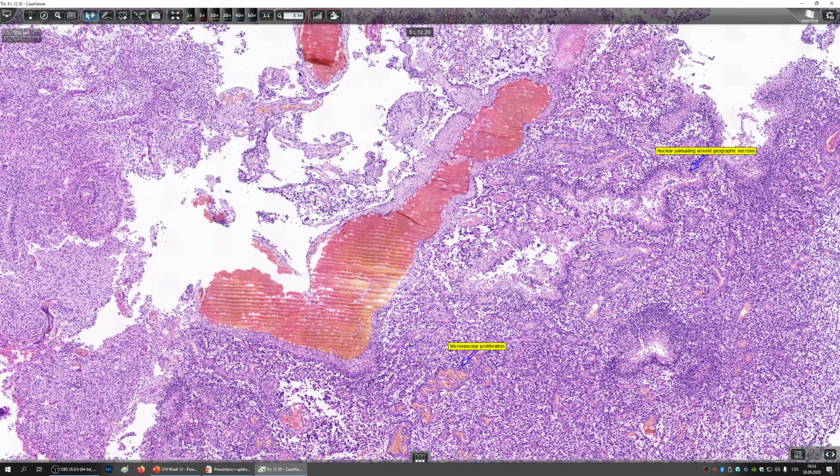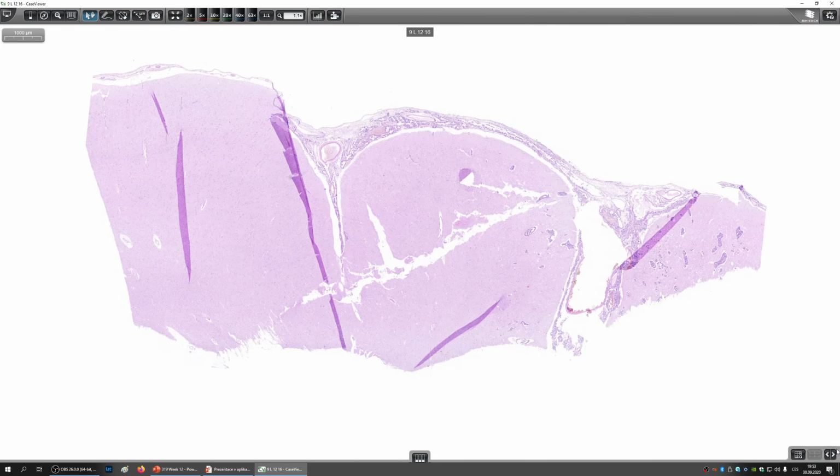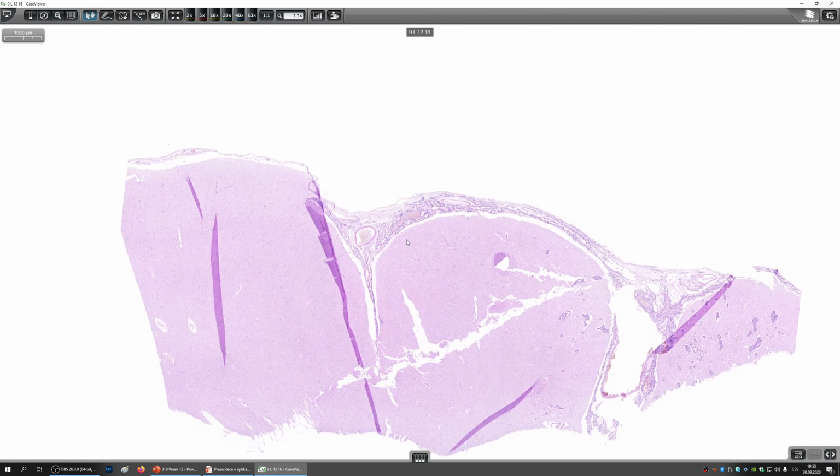It's very common to get brain metastases in advanced cancer, especially carcinomas of the lung, colon, prostate, kidney, breast, and so on. So some cancers are a bit more prone to causing metastases than others. Here's the first thing that can happen, the so-called carcinosis of the meninges. In this case, you don't get a completely obvious round area of metastasis, but you get diffuse infiltration of the meninges.